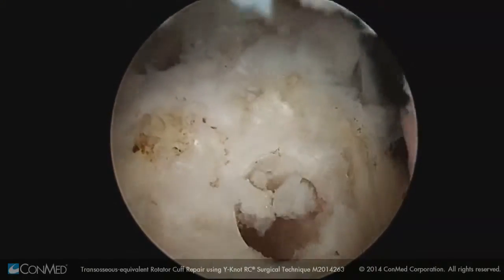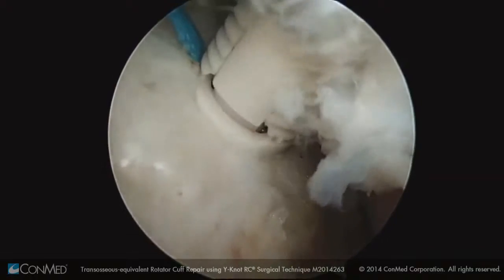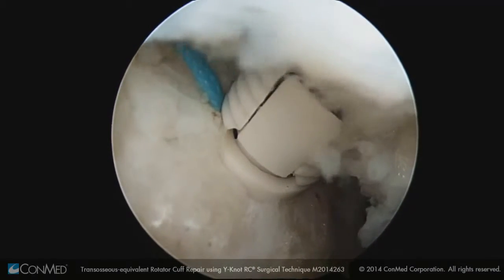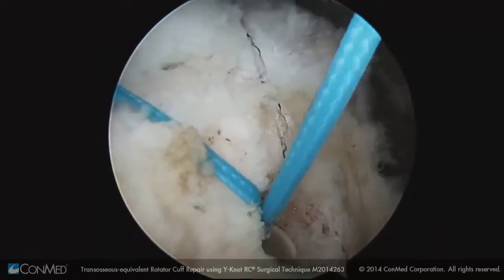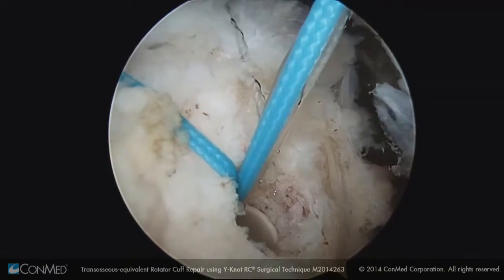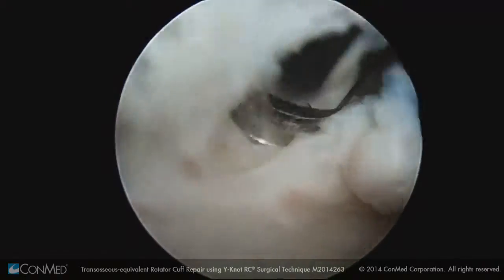We have just tapped the hole for the anterior of the two pop lock anchors that we're going to use. Here we are driving that pop lock anchor into position after we have passed the two suture tails through the locking mechanism of the anchor externally. Once the mechanism is fired, the sutures are firmly locked. We can see the lateral tip of the anchor in its appropriate position there, and once we have cut the suture tails, they are flush with the cortex.